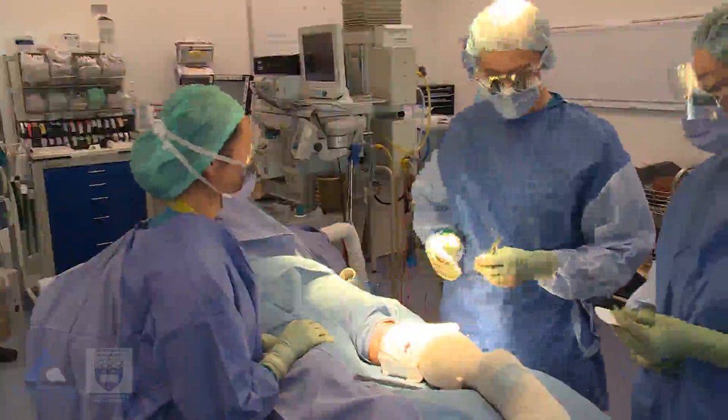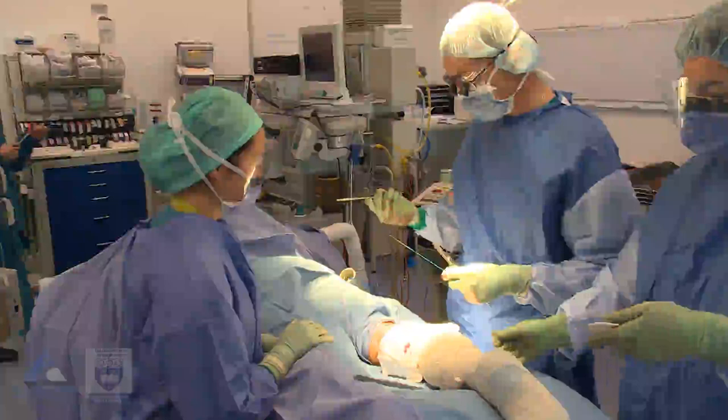Alright, well let me demonstrate it first. We're going to use a 3-O Prolene, 3-O Etherbond. So, this is a vertical mattress suture.